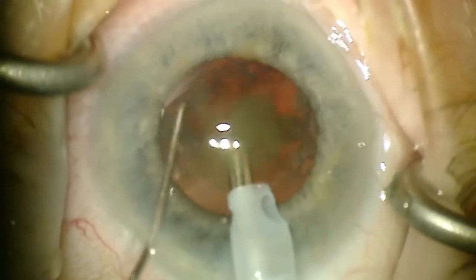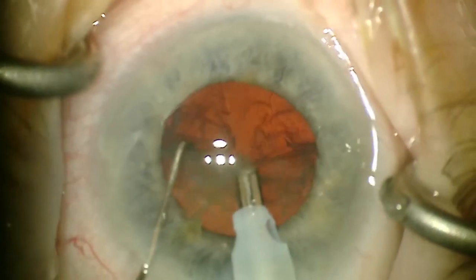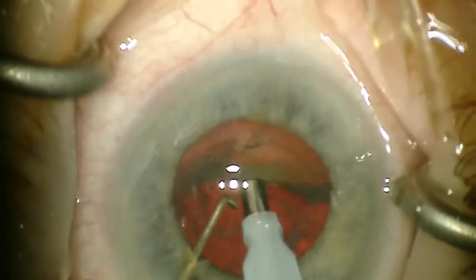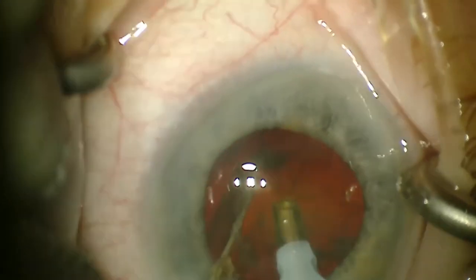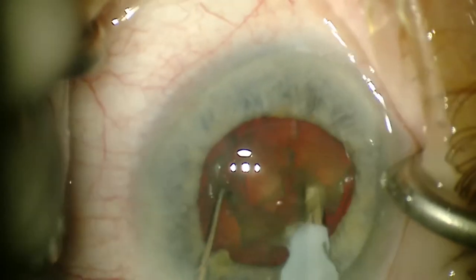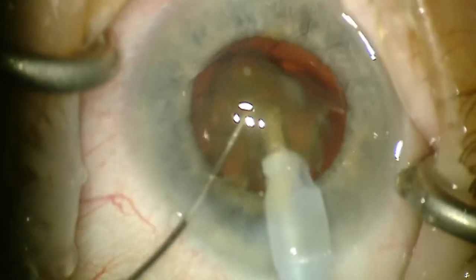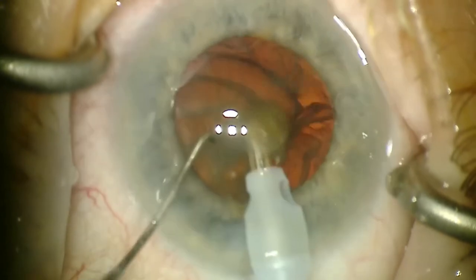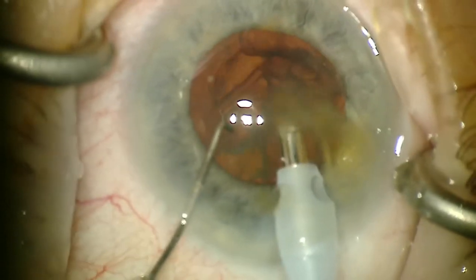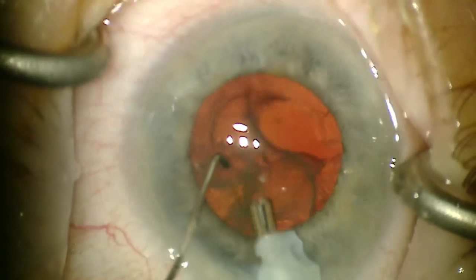This is not too dense a lens, about a 2 to 2.5 plus NS, and you can see the Stellaris unit with Venturi-type fluidics is easily able to disassemble the lens and aspirate it quite quickly with FACO emulsification. This is in real time, a non-edited FACO here. I typically just do a four quadrant chop, sometimes a six quadrant chop.